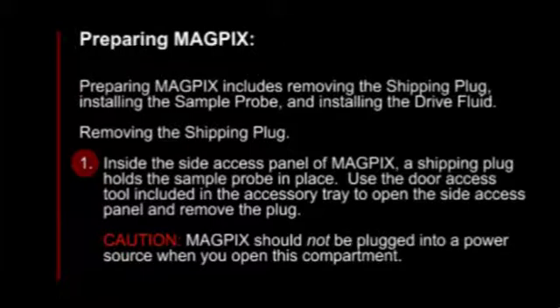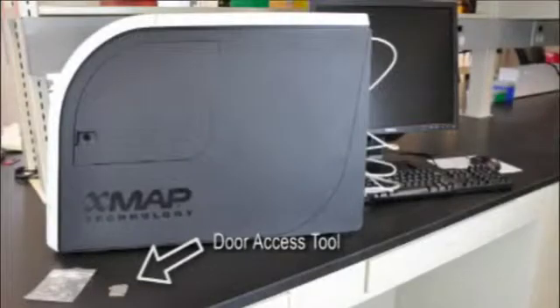MagPix should not be plugged into a power source when you open this compartment. Next, locate the door access tool in a small plastic bag in the accessory tray of the overpack.